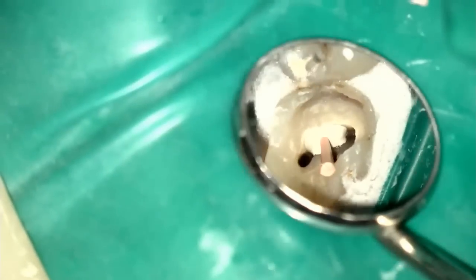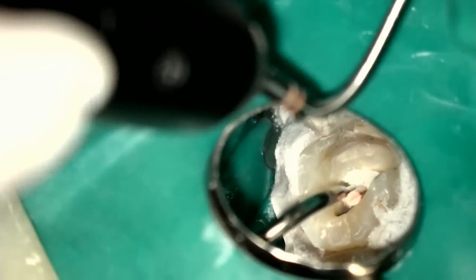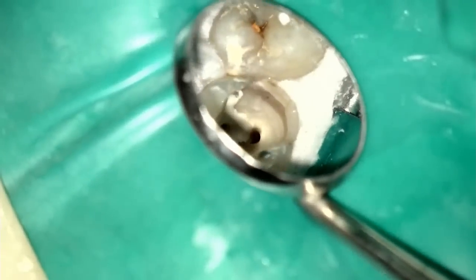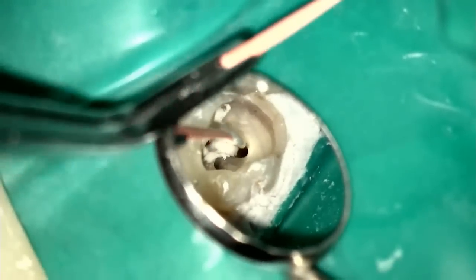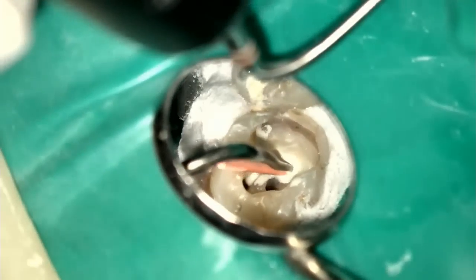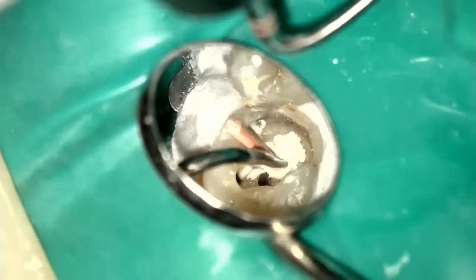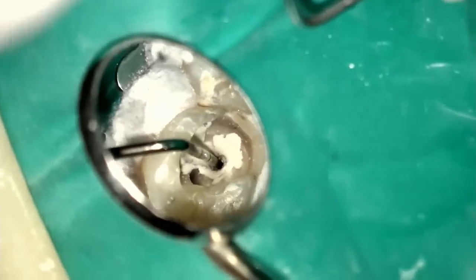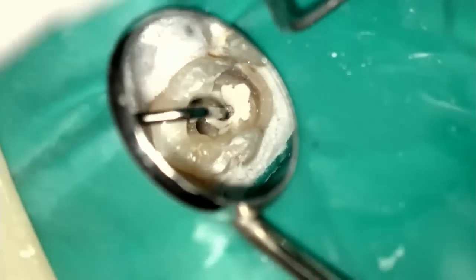The canal chamber is nice and dry, the canal orifices are nice and dry. I apply a little bit of sealer — you'll notice I'm not putting in a ton of sealer. We down-pack to five to seven millimeters from the apex, usually about five millimeters. I'm not overly concerned about packing every time to within three millimeters of the apex — as long as I can get to within five or six millimeters, I'm really going to be happy. Here goes — that's the palatal canal I'm packing down.